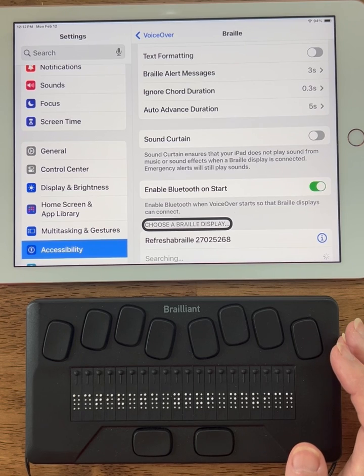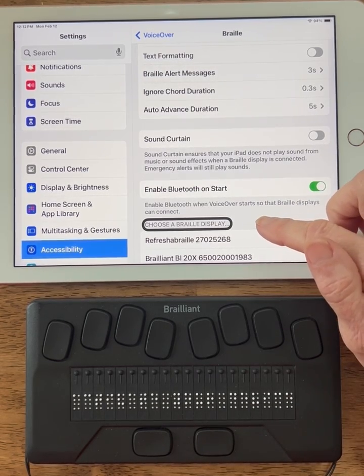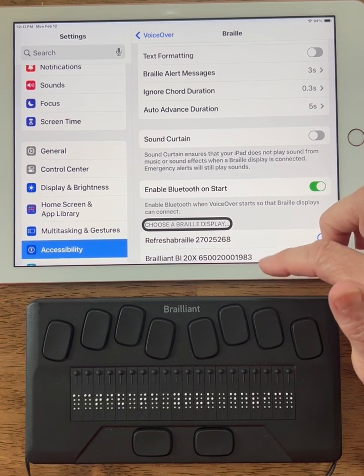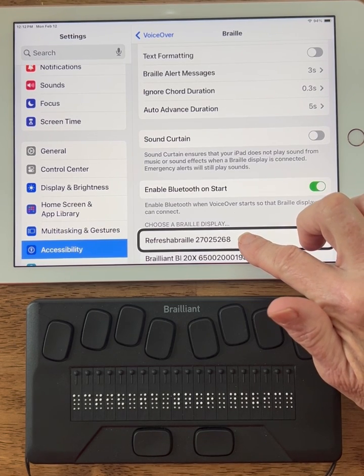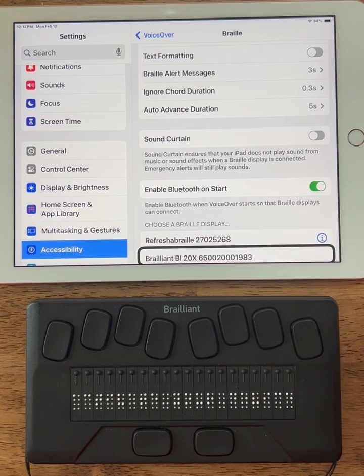It says 'Activate your device and your host device's Bluetooth settings.' Then it shows the Brailliant BI 20X followed by the serial number. That long number is the serial number of this particular Brailliant. Now if I go back to my iPad — I was on 'Choose a Braille Display' — if I come down, it tells me what Braille displays are connected. I actually have another Braille display, and now I can see the Brailliant BI 20X with its full serial number.